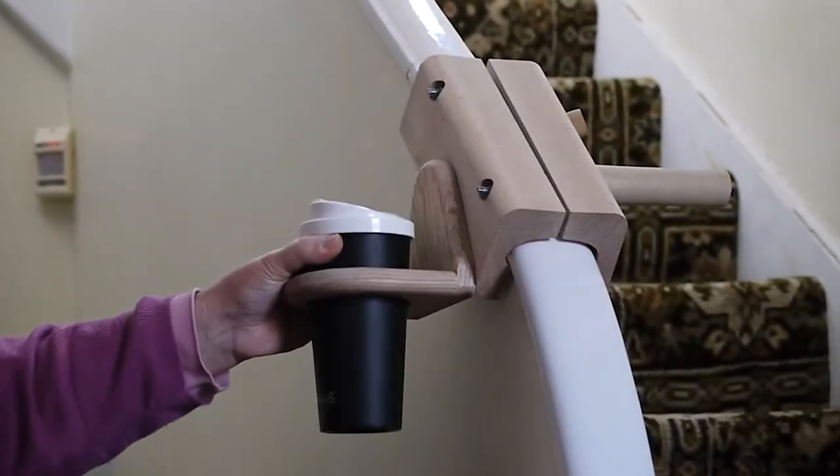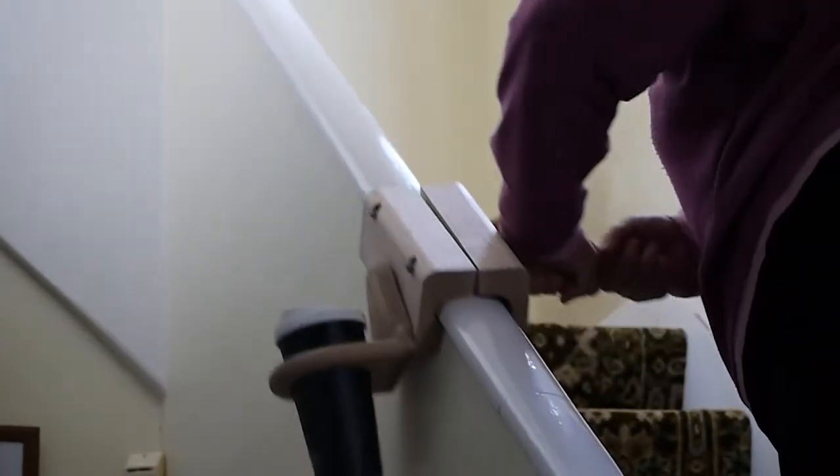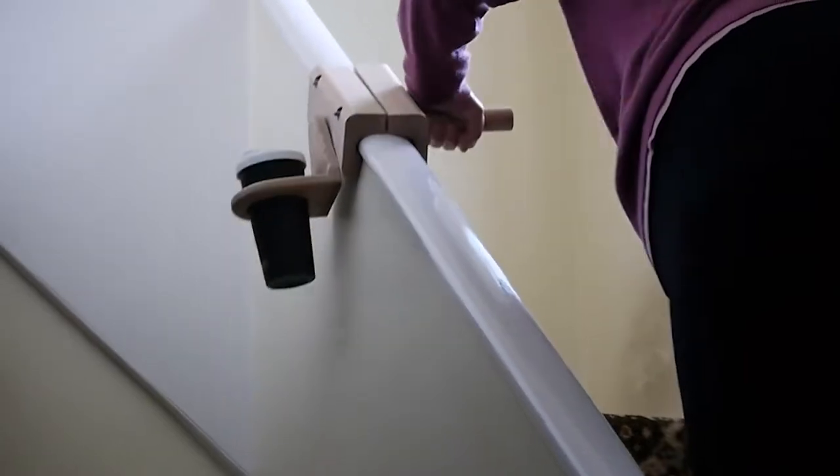Normally I have to put whatever I'm carrying up the stairs ahead of me on a step, then walk up to that step, and then put it ahead of me again. The device helps me because I'm able to take it up with me as I go up the stairs.